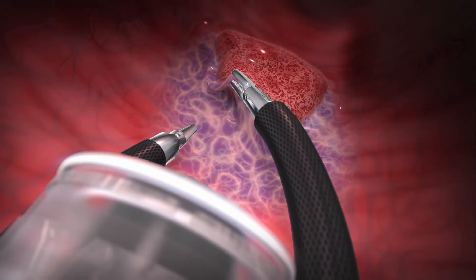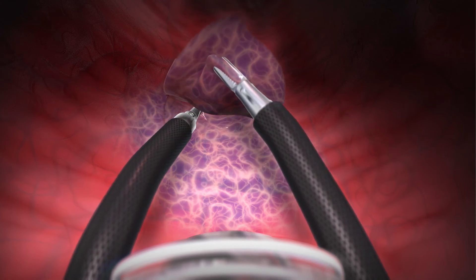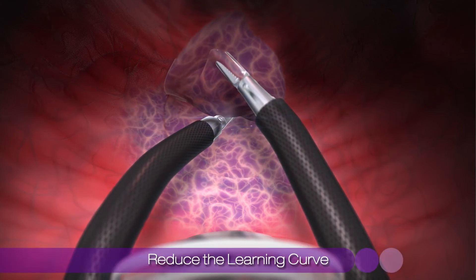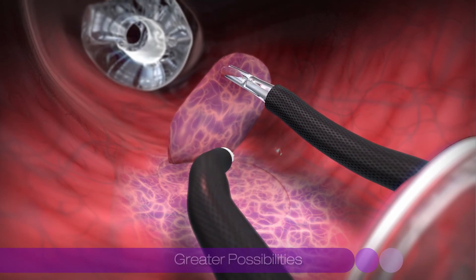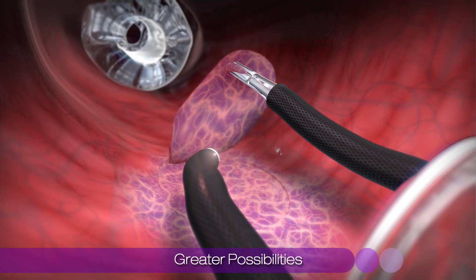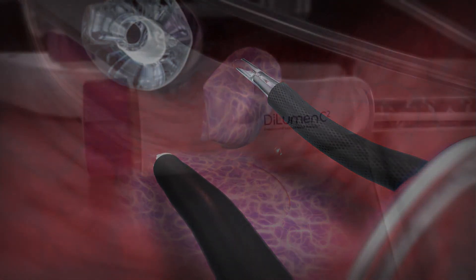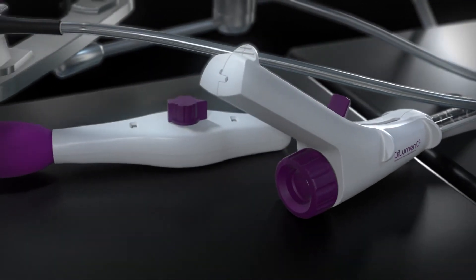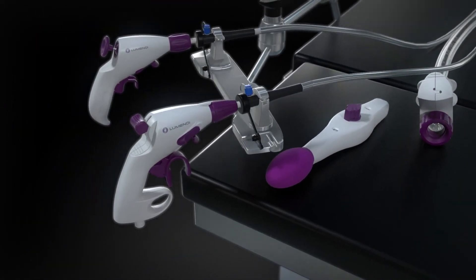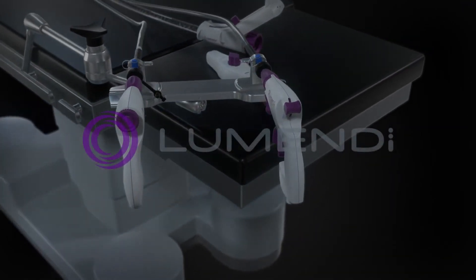These new tools, along with standard endotherapy devices delivered through the endoscope's working channel, may reduce the learning curve for complicated endoluminal procedures and offer greater possibilities to treat diseases of the colon in a more controlled and precise way. Lumendi is proud to lead the way in developing the devices that will result in shorter procedures, faster recovery times, and lower costs to the healthcare system.